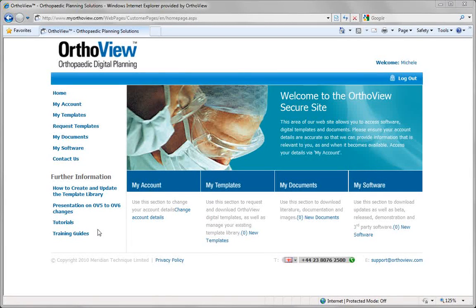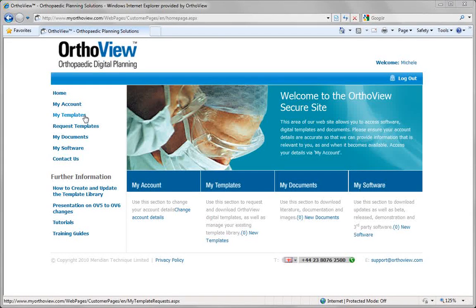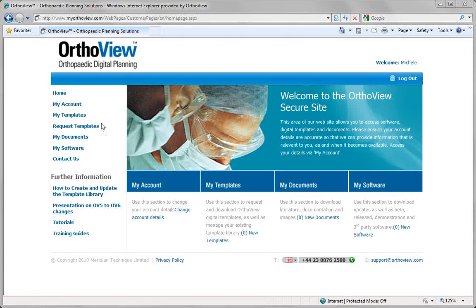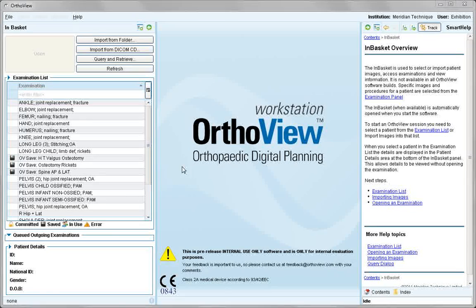The key pages of interest will be My Templates, where your template list previously selected is stored, and Request Templates to acquire new templates. Once the template selection for the site is installed and your images are available to you, you can start the active part of the OrthoView session.